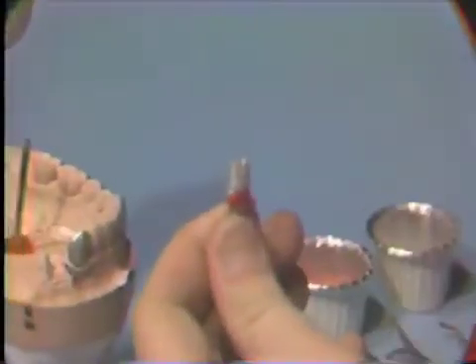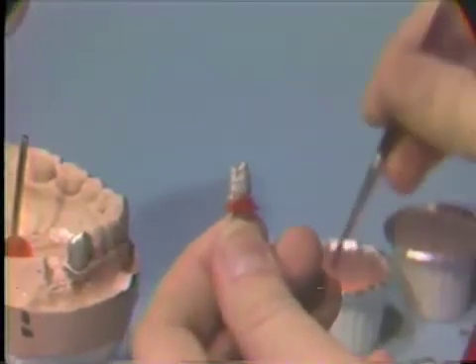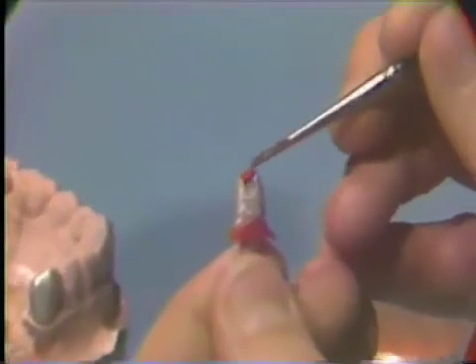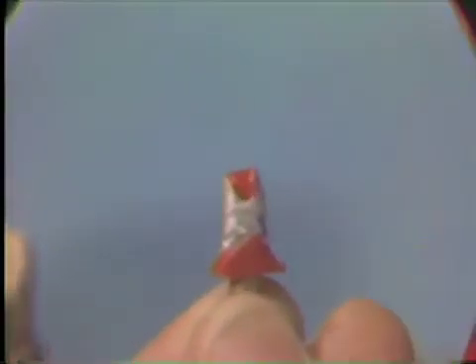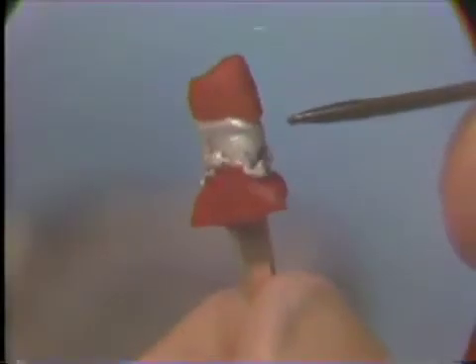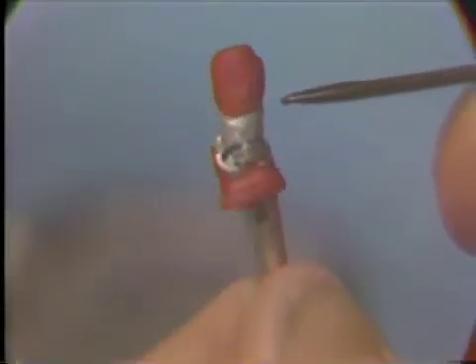Remove the die from the cast and lubricate it with Duralay lubricant. Paint on red Duralay to build up a coping over the die for the wax up. The Duralay should be painted on carefully and slowly to ensure that it is thick enough to provide stability but still allow room for the inlay wax over it. The coping should be finished just short of the margins on the die.